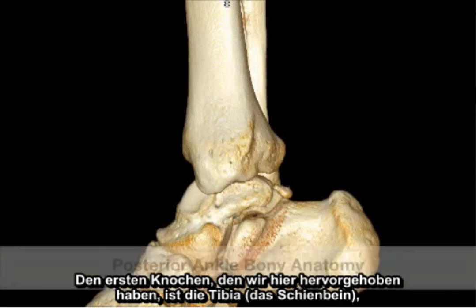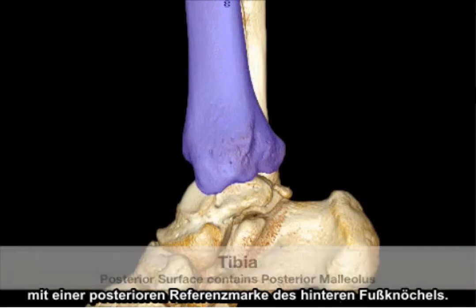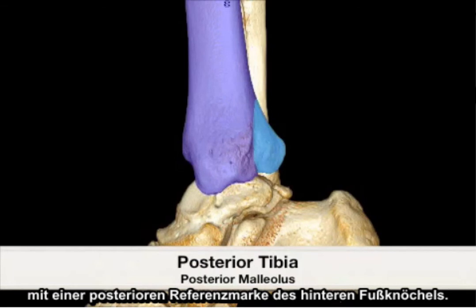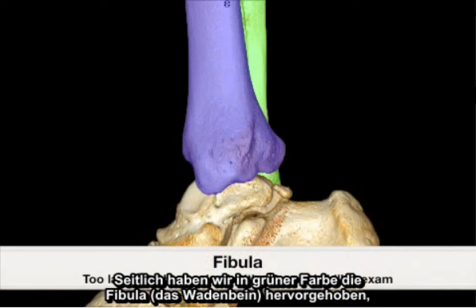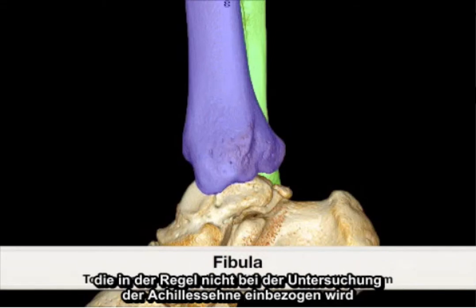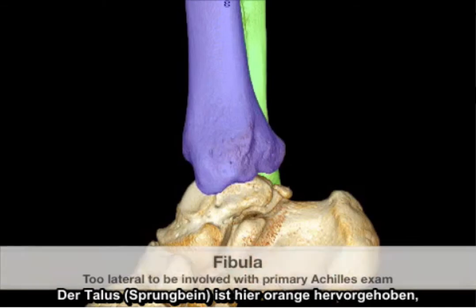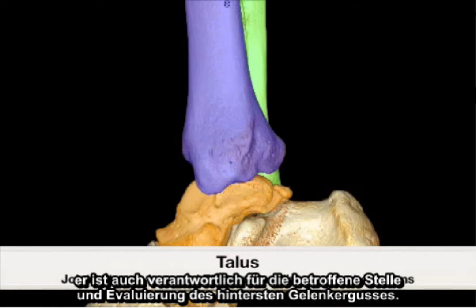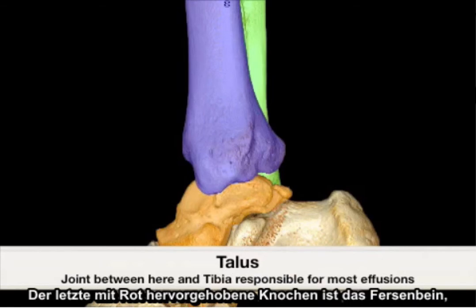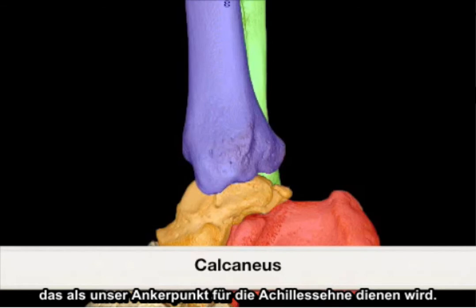The first bone highlighted here is the tibia with the posterior landmark of the posterior malleolus. Also laterally in green we have highlighted the fibula, which is typically not associated in the Achilles tendon examination. Highlighted in orange is the talus bone, which is responsible for evaluating most posterior joint effusion. The last bone highlighted in red is the calcaneus, which will serve as our anchor point for the Achilles tendon.